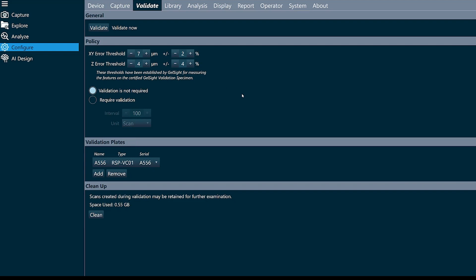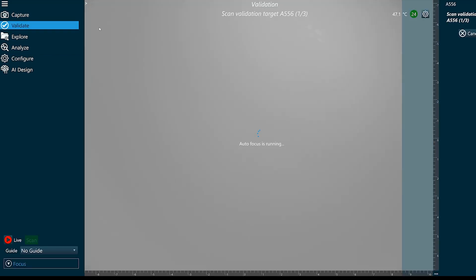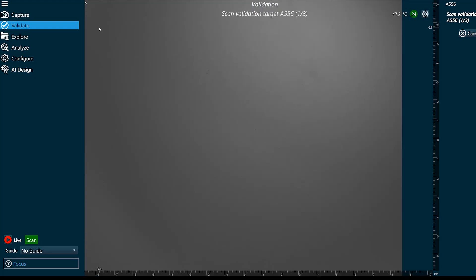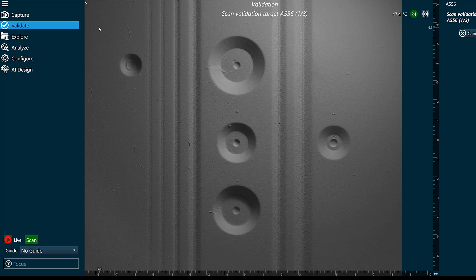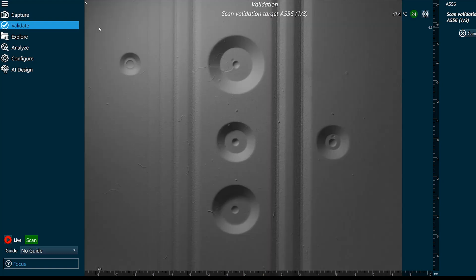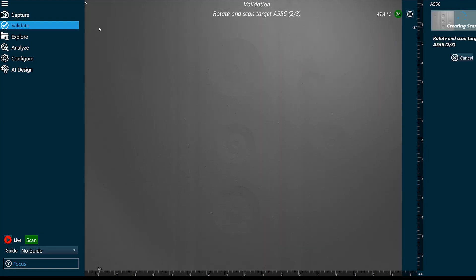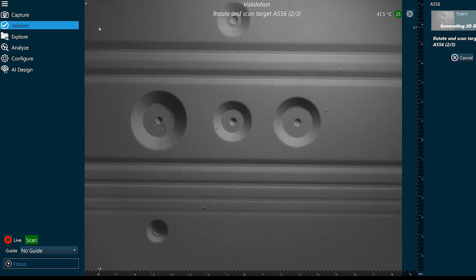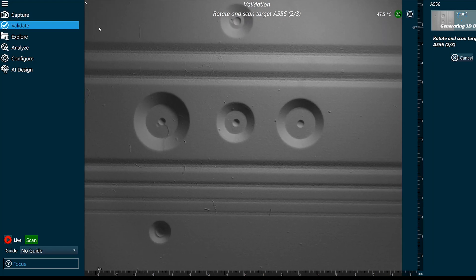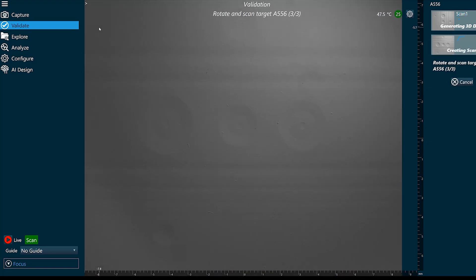Next I'll click the validate button. Autofocus is going to run and then I'll be able to scan my validation target. We're going to scan the validation target three times, rotating the target each time. We want to ensure we're reaching the bottom of each of the grooves. It's not necessary to see the bottom of the holes as we're just looking at the diameters of them.